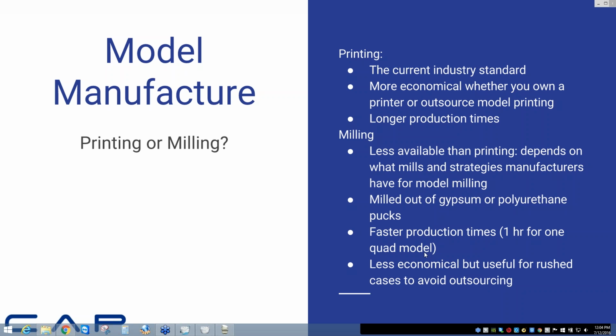Let me see. A question about printing times. For different models, it does vary quite a bit depending on what printer you have. For example, our Stratasys printer, I believe it's based primarily on the maximum height. Because printing always happens in layers, you'll find that adding more models doesn't affect the time too much compared to the maximum height of your models. So if we're doing a full batch in our Stratasys printer with just an average height, it can take about 4 to 6 hours.